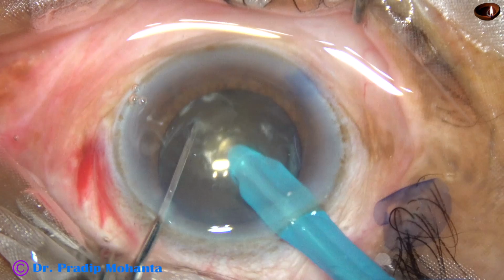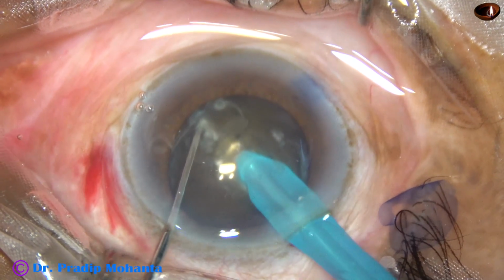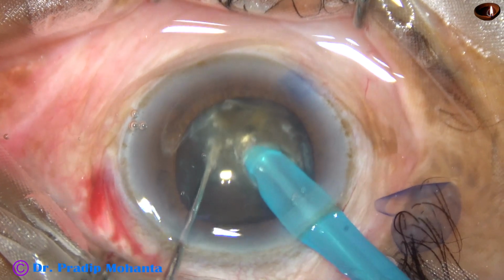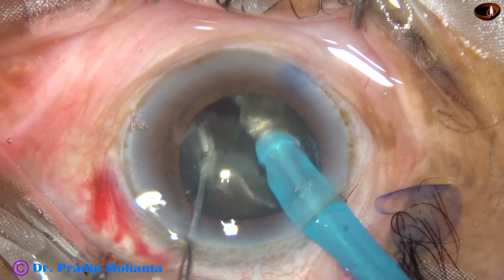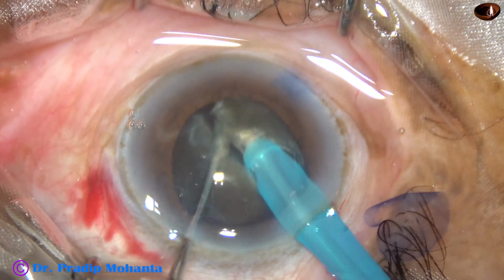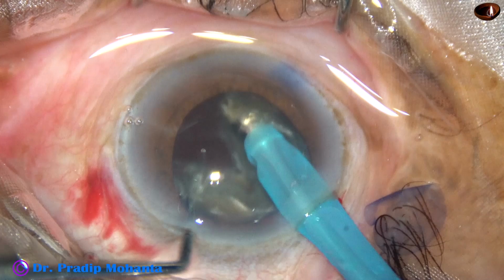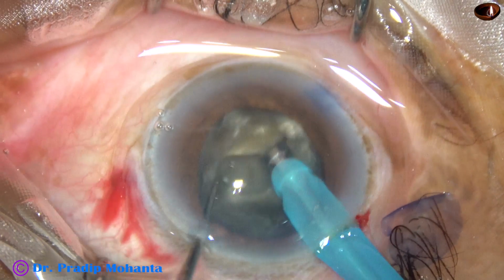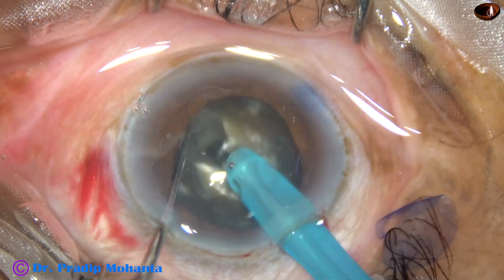through the nucleus, crosses the center, reaches the midpoint between the opposite equator and the center of the anterior pole, and it just cracks the nucleus in this way. And this is not a long chopper, this is a very short chopper. The length of the prong is about 0.66 millimeter.